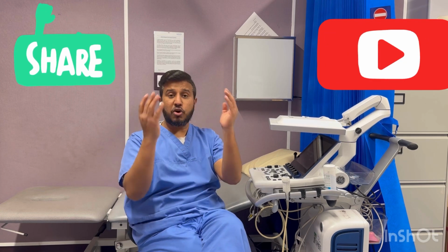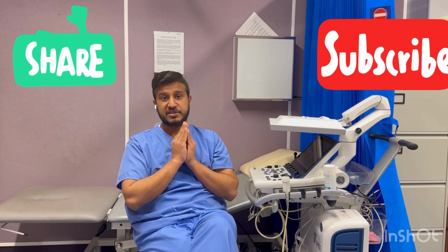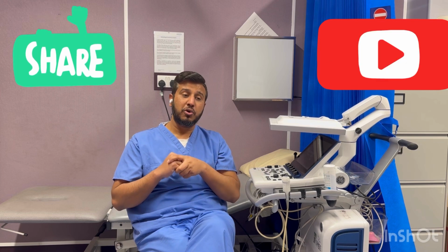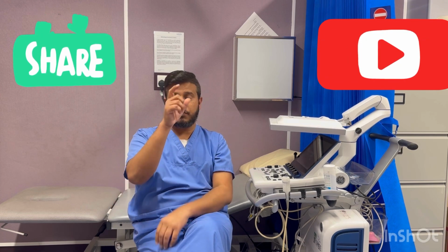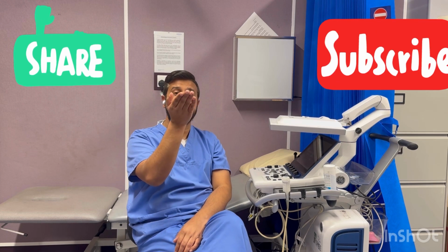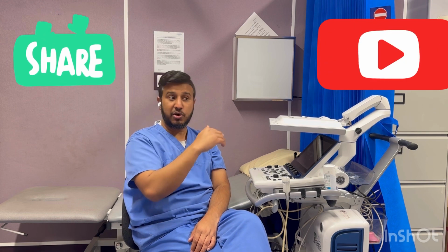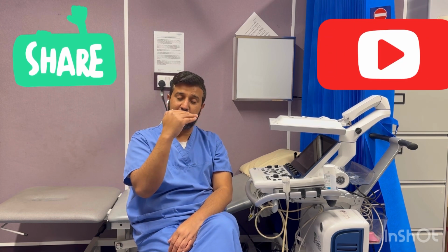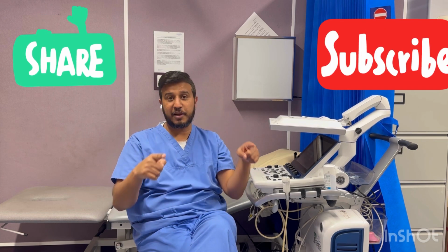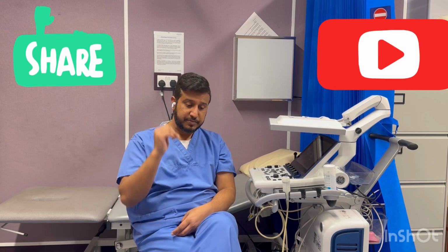Okay, so all these things, parasternal imaging, you will be doing from the second to third intercostal space. By the way, in some patients where you need to look at the pulmonary arteries better, like for example the pulmonary artery and its branches, you will go one space up from your imaging plane, like what you did for the ascending aorta. Go one space up, and you will see a very clear pulmonary artery and its branches. Okay, so this was another trick.